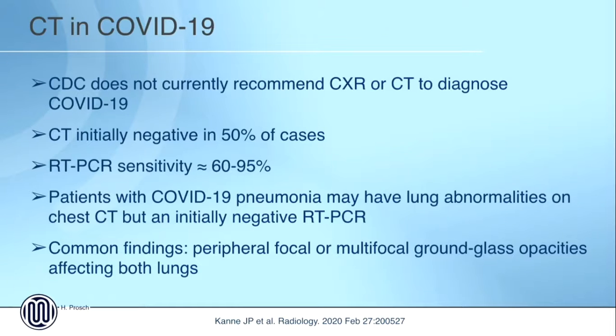One is that, again, although characteristic, these findings are not specific. And if you are sending a patient to the radiology ward, you have to transport a patient throughout your hospital, and you then probably expose other patients and also run into the risk of exposing personnel. So if possible, avoid CT scan unless you have suspicions of superinfections, complications, or whatsoever. However, in cases in which your RT-PCR gets saturated, meaning you do not have enough tests, then CT is the way to go. It's not chest radiographs.